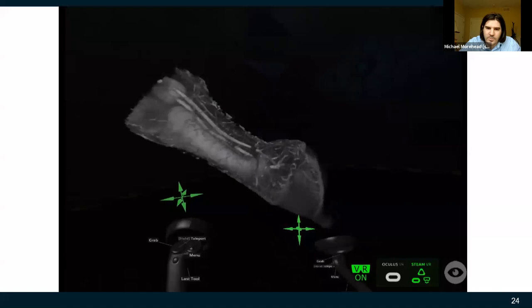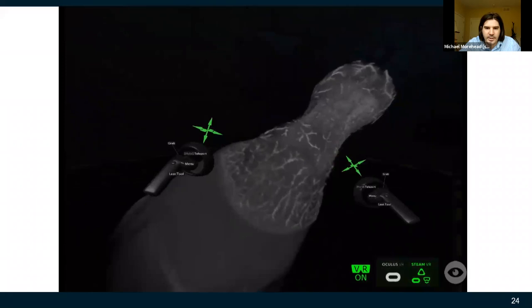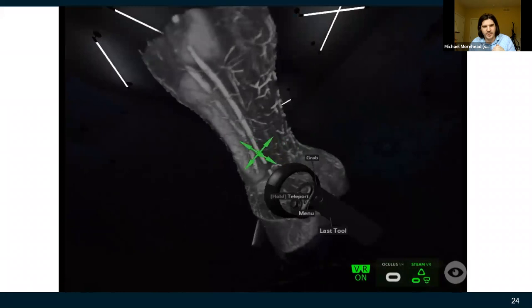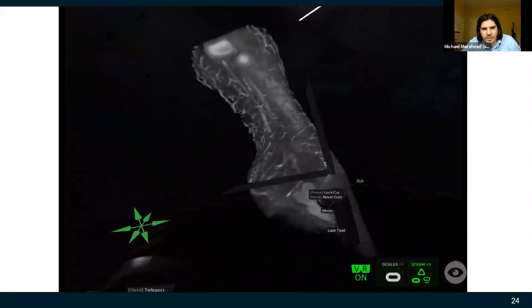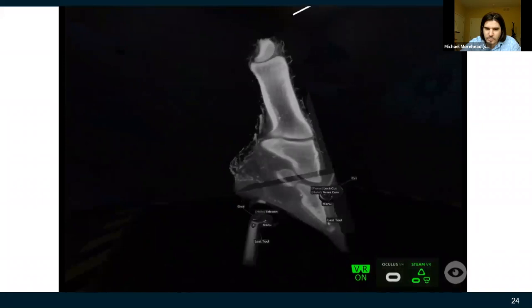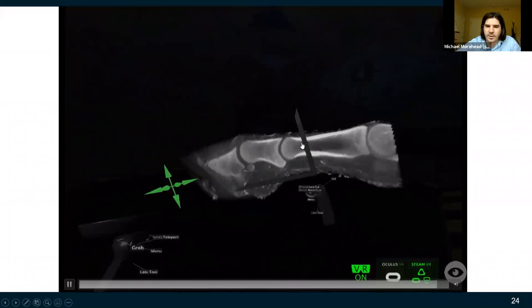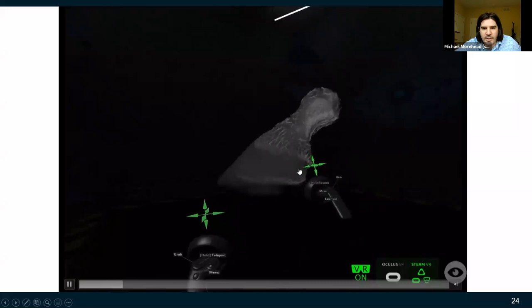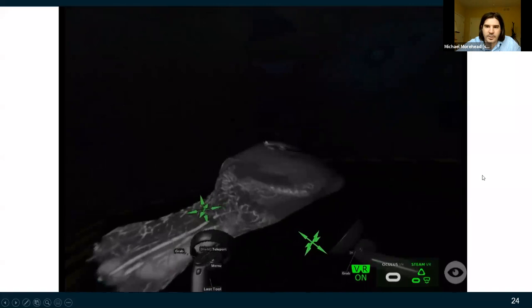Now let's look at the horse's hoof CT in Syg lass with direct volume rendering applied. I was really startled when I loaded this data because slice by slice it's super blurry and fuzzy, but stacking all the images up in direct volume rendering — it's like holding a hologram — you can really understand the structure of the bone and the blood vessels that ring the horse's hoof. Things my mind couldn't connect slice by slice become very clear.